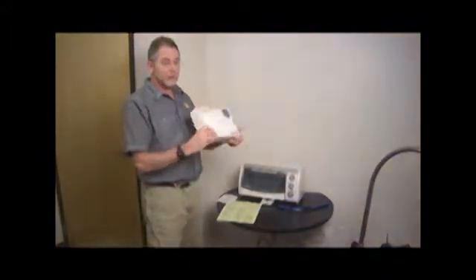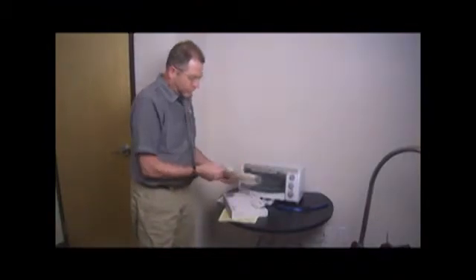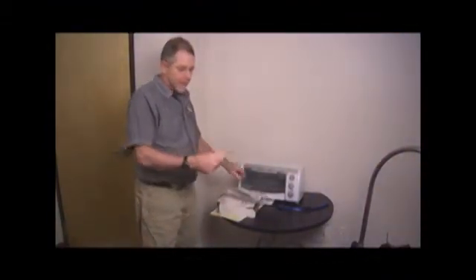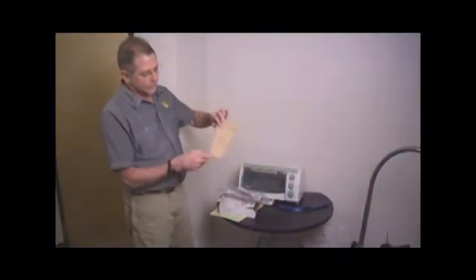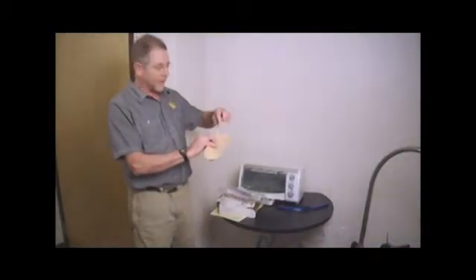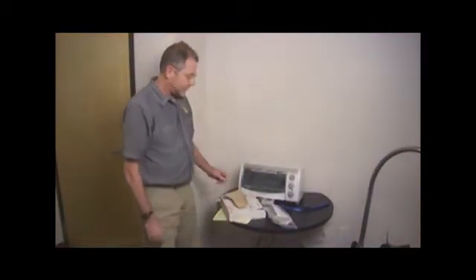If you're using a large core and it doesn't quite fit into the box, you can take a pair of shears and cut off the distal end of the impression core, a half inch or whatever is required to get it to fit into the box. So basically, all we need is from the first MPJ to the back of the heel. So anything up in here that's not being part of the orthotic can easily be cut off. Occasionally, the large cores are a little hard to fit in a standard size box.